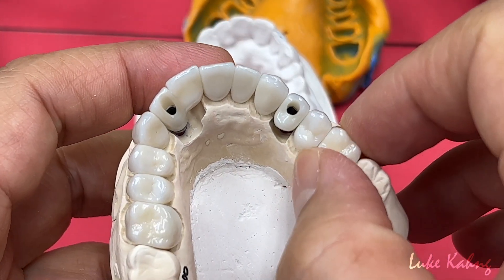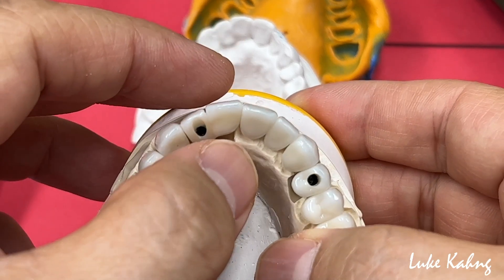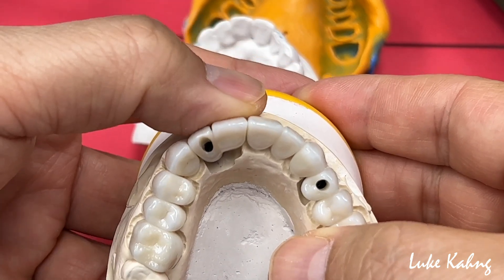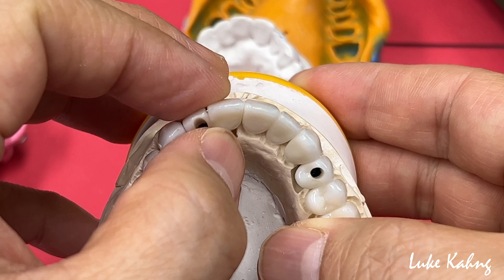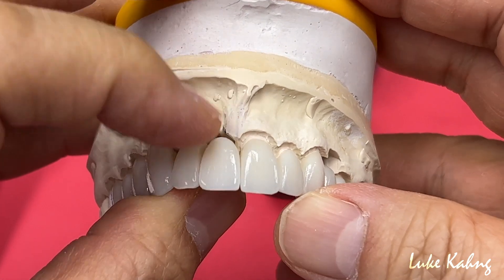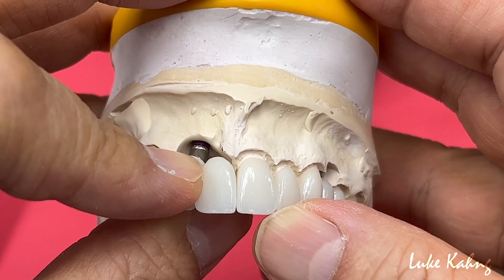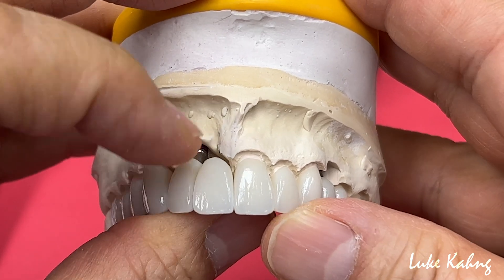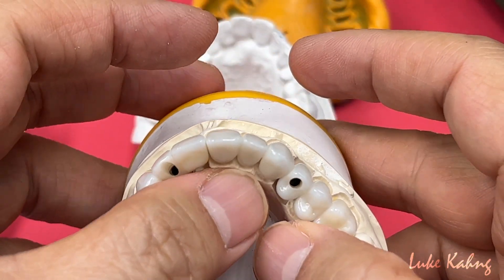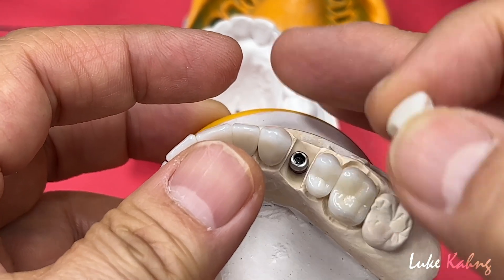Now, before we cement, it's trying to get the monolithic. It's a little bit tricky because of the cantilever, so we have to cement it really good — just like that. It's not facially out. Trying to get the good position so I can get good symmetry — it was a hard time to make it more symmetry as much as possible. So after cement, I'm going to double check the contour between 8 and 9. Right now it's really good. Here is a regular cement, and this one is a bleaching color, so I'm going to cement with white opaque cement after gold anodize it.